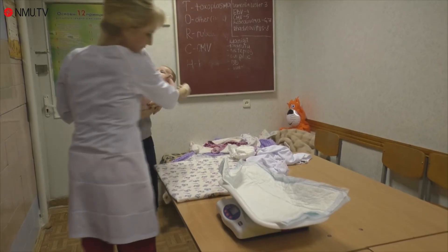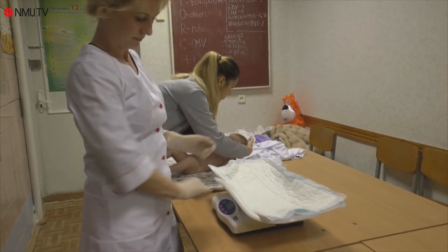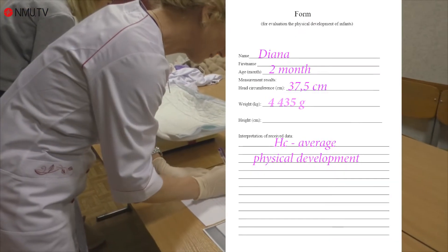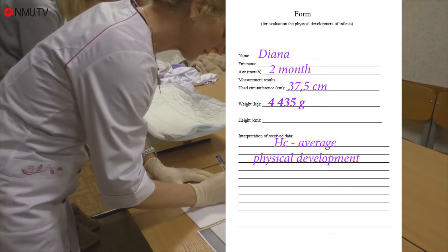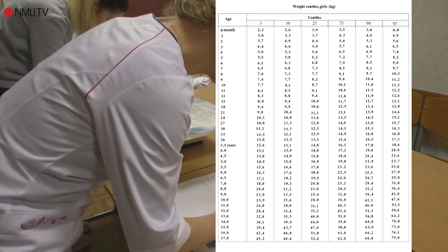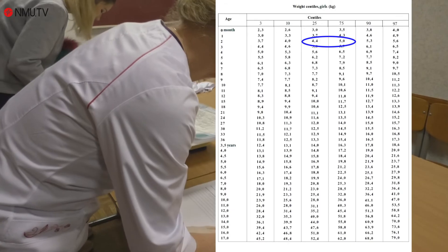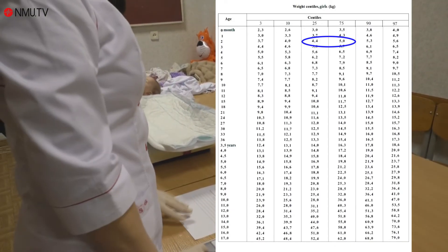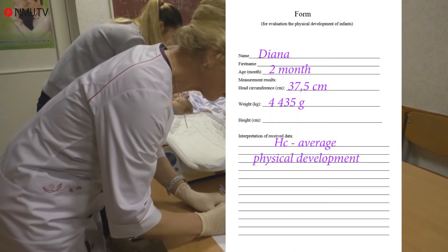Mother can dress the baby with diaper and blouse. We record the results and compare them with the centile tables. The result is between the 25th and 75th centiles, which corresponds to average physical development.